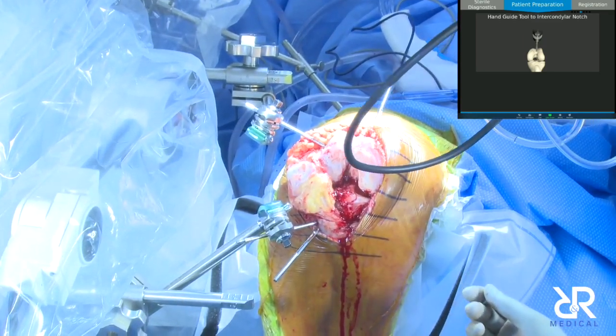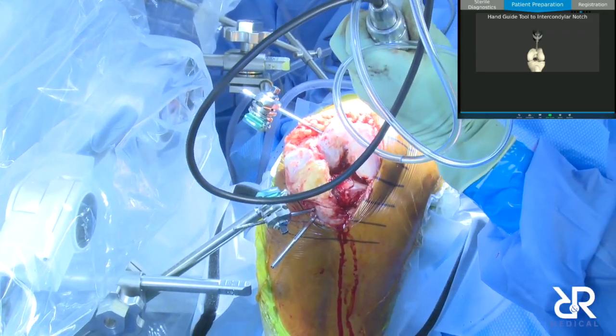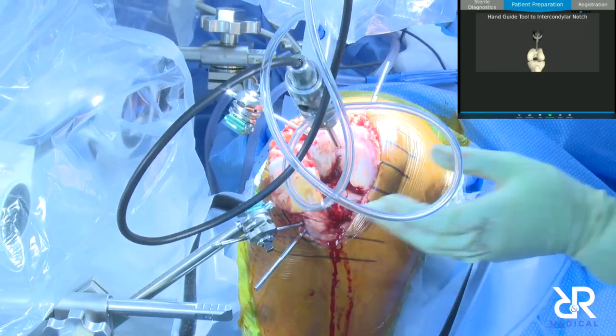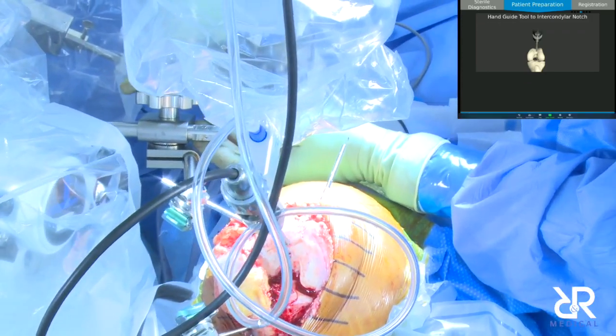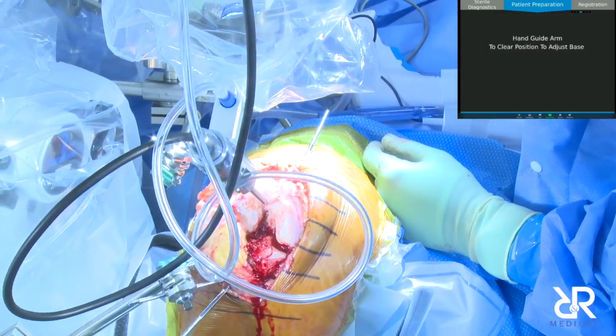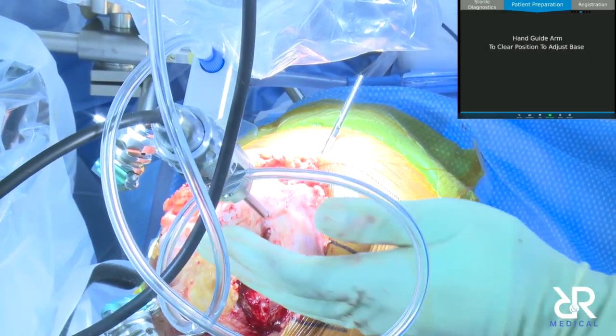All right. So now you put the robot right where the entry canal of your femur is. That's the position you have to place it in order to do the so-called space check, making sure that the robot can cover everything.